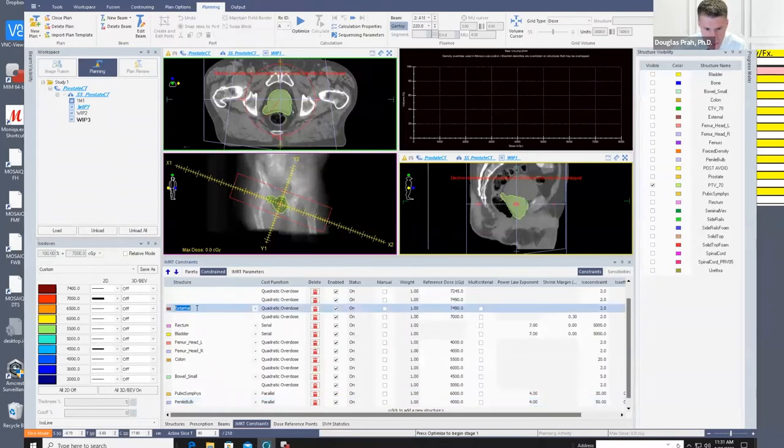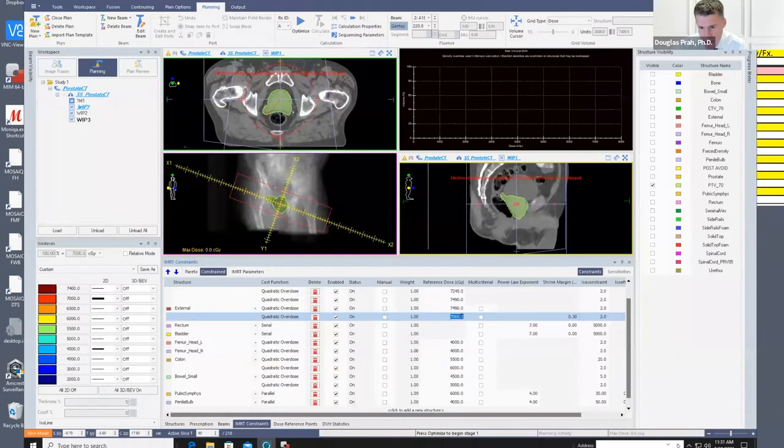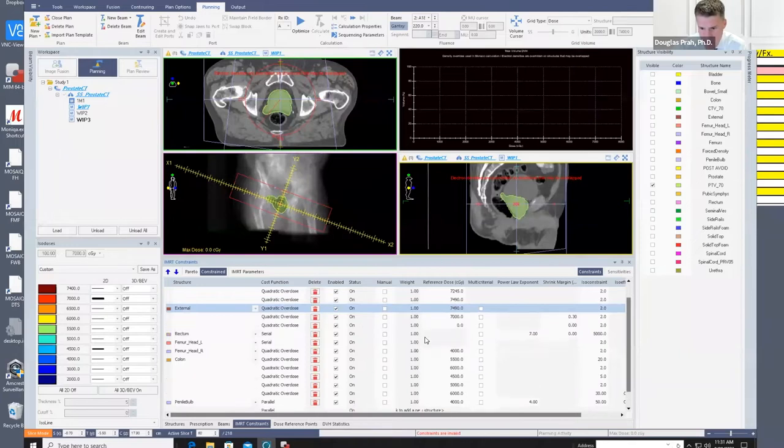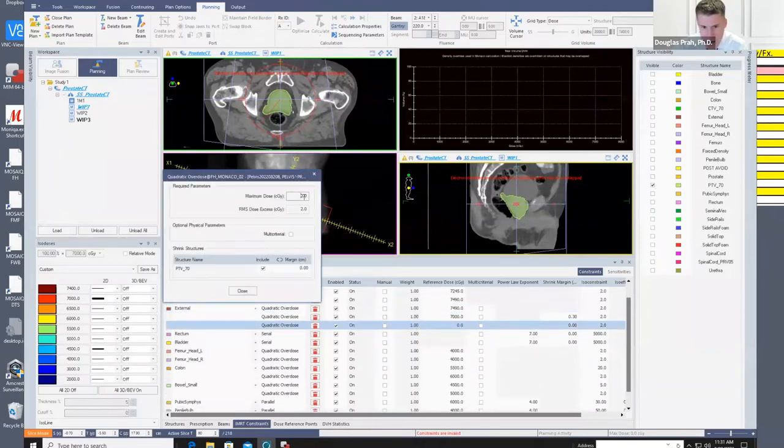So let's get back to this external. Right now I've controlled the max point dose inside of the target, the entire patient. I'm controlling the prescription isodose line of 70, but let's come in and actually add a couple other lines now. You can pick however you want this, but let's say we put in a 6,000 here and we ask ourselves, well, how much distance can we go between 70 and 60 gray? I think that gradient we can do about 3 millimeters. My guess is it's going to be like 3 to 6 millimeters. So let's just stick with 0.5.